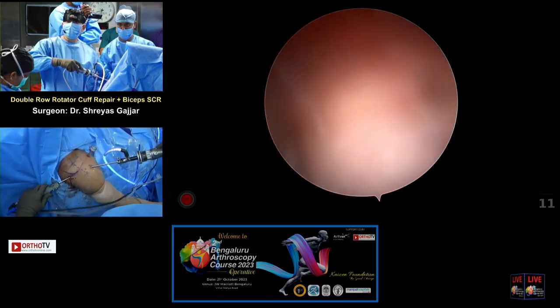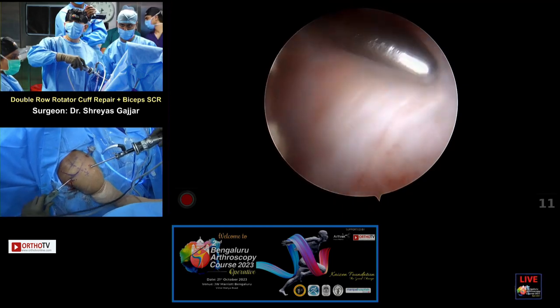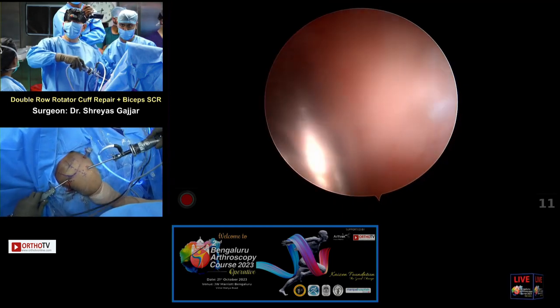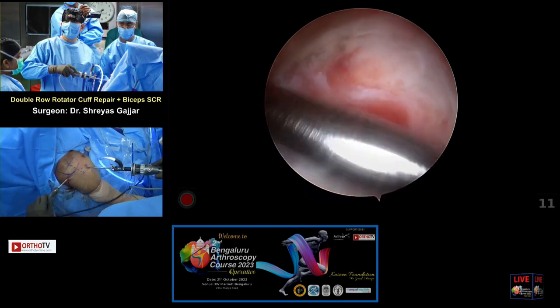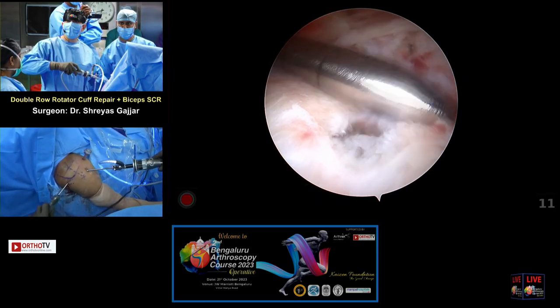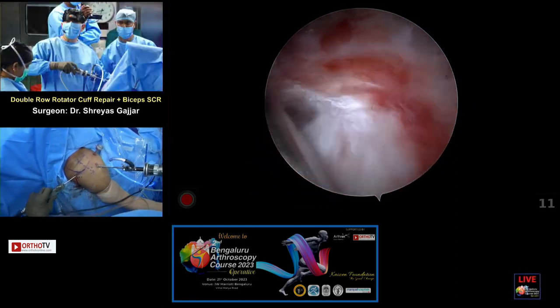When one uses the shaver, there will be a bit of bleeding, so that is expected. But I think it helps me. This is a torpedo shaver blade, which is a non-aggressive blade. It helps me take away just the bursal tissue without damaging the cuff. I find it quite useful for rotator cuff surgery. So, you know, the tear is slowly coming into our vision.